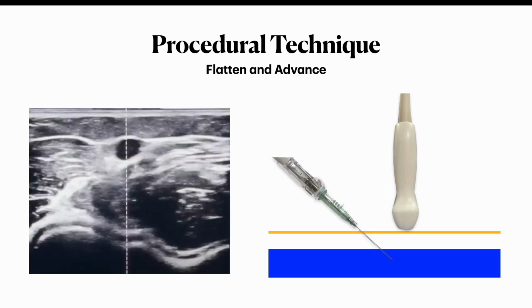This can also be conceptually difficult to understand, so let's go ahead and break this down and give you one more key tip. In this example, I'll ask you to use your imagination and pretend that our catheter is flashed and filled with blood here. So now that we are within the vessel, we will flatten our needle, and then we will slide the ultrasound back so that we can visualize the needle on the screen.